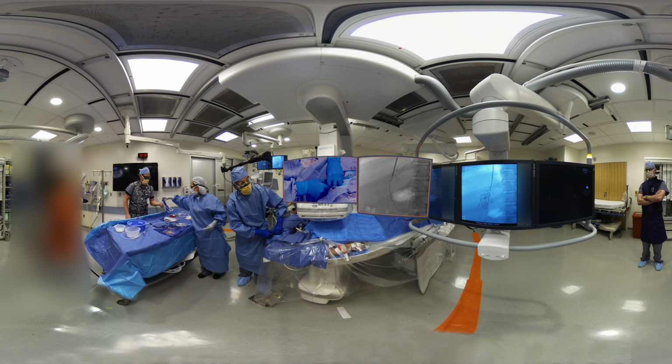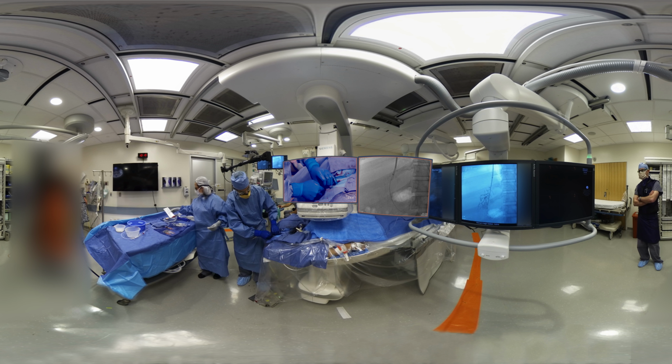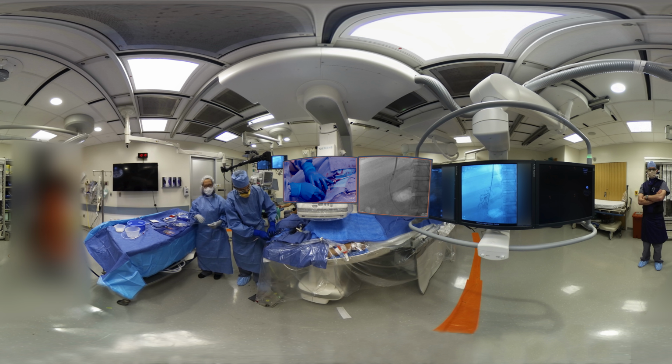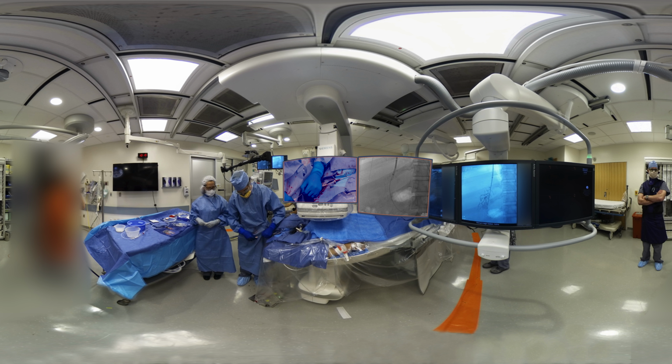So we've got it down there pretty firmly against it. That's as far as it goes. I can feel it stop. Let's lessen the magnification. Next thing we're going to do is work to get our needle out. So we'll do this step by step.